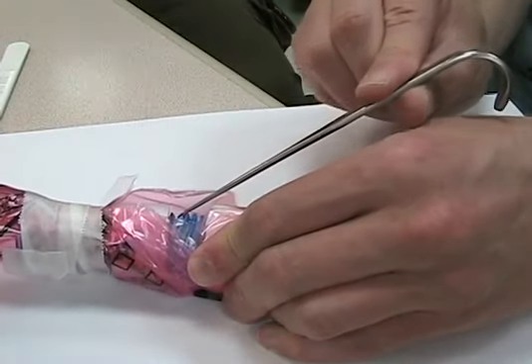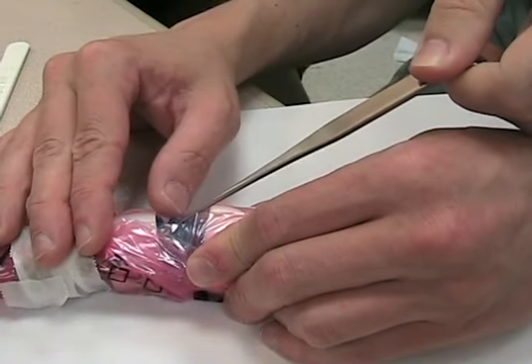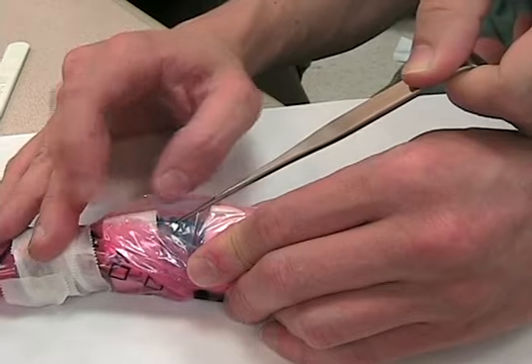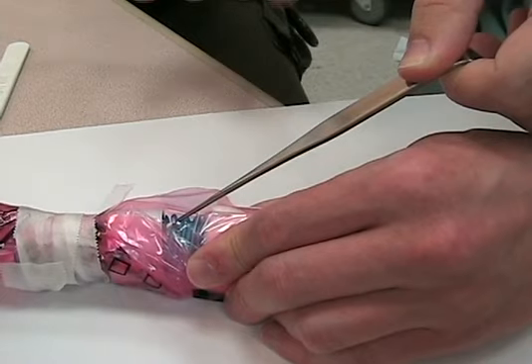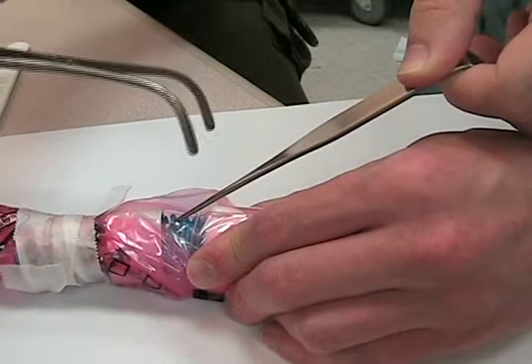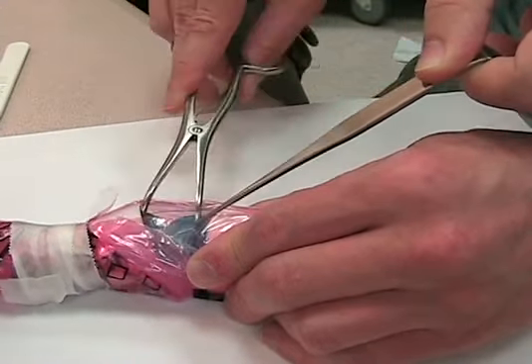You're going to hand the hook off to a partner and retract towards the head. So now they have the hook inside the trachea holding up the membrane, facing towards the patient's head. The next step is the dilator — the dilator wants to open up the trachea vertically, not horizontally. Vertically. Pop that in and open.